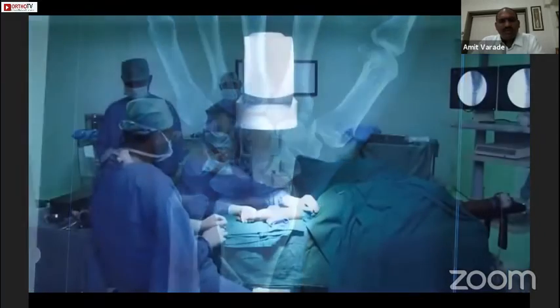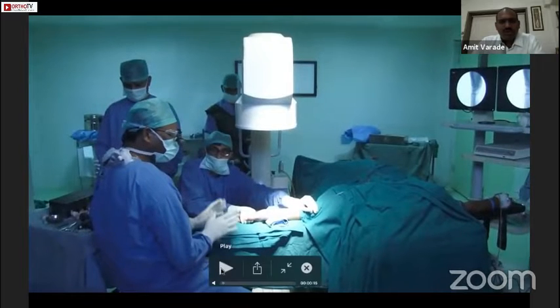We decided to fix it with the Herbert screw — more properly called a headless compression screw. The proper position in the operation theater is that the surgeon should be sitting on the hand side of the patient and the monitor should be on the opposite side.